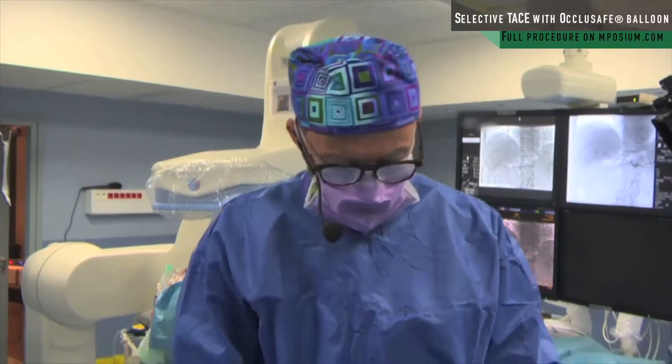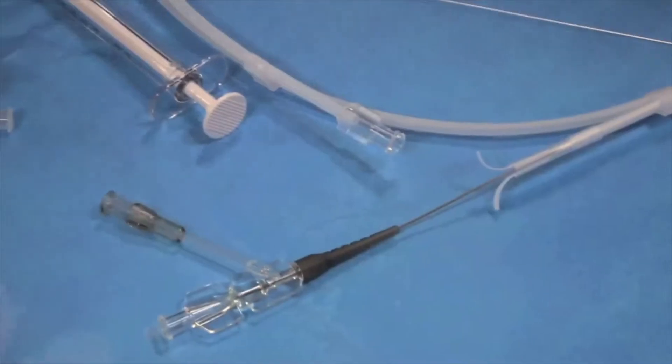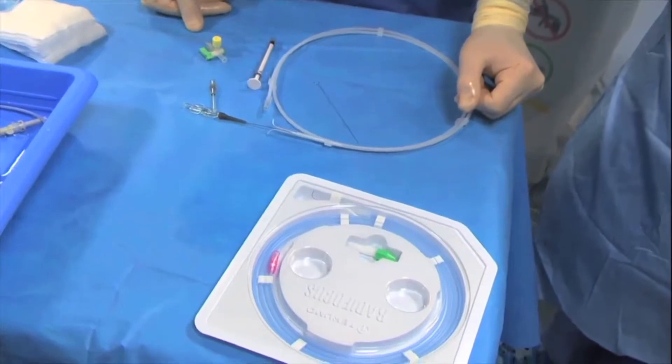For this balloon test, I will use an Occlusafe from Terumo. This is a micro catheter, and I will use a 0.014 guide wire from Terumo, which is a GT 0.014.